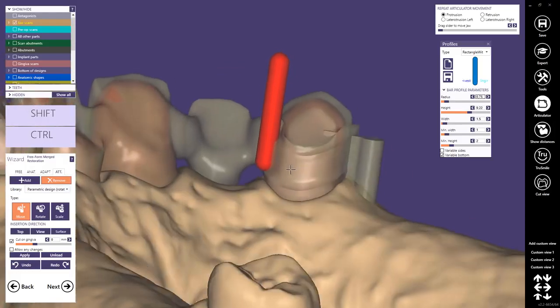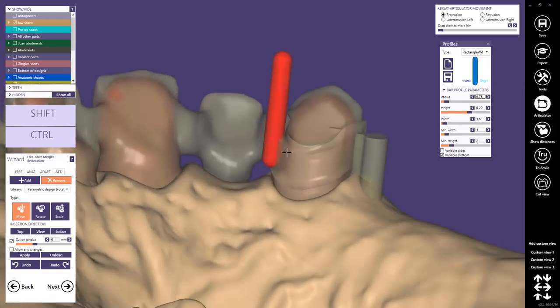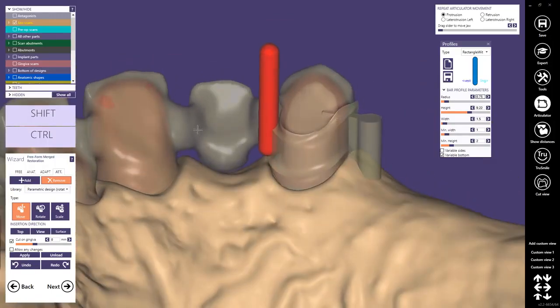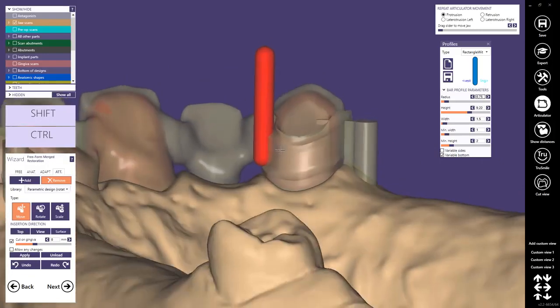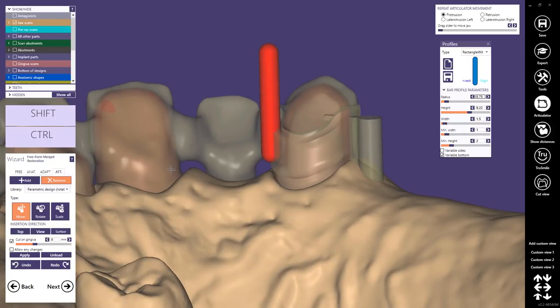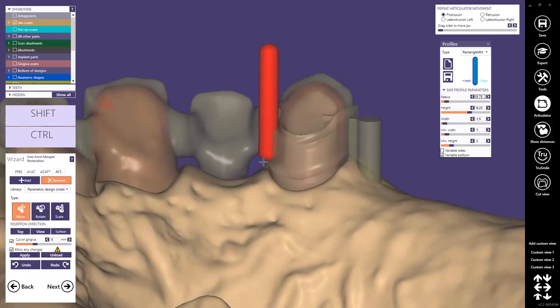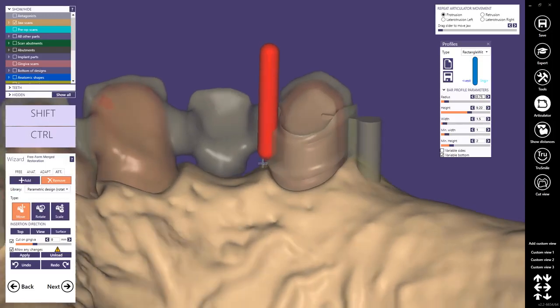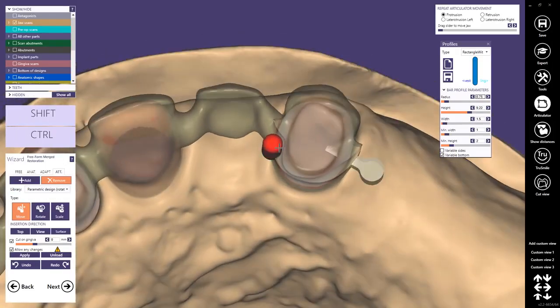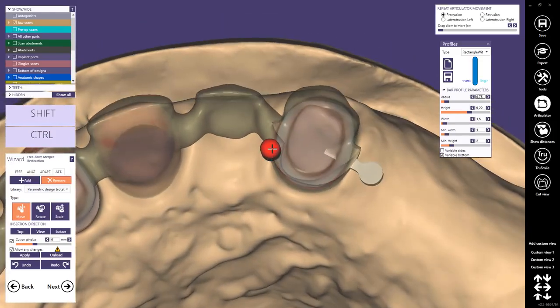I change the transparency to view the minimum thickness. This will be recomputed if I intrude the minimum thickness, but we can take the decision to violate the minimum thickness if we want, and yes, this is allowed. We have a nice minimum thickness of 0.6, and in this region we could also measure with the cut view tool.